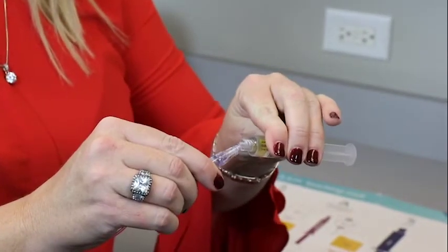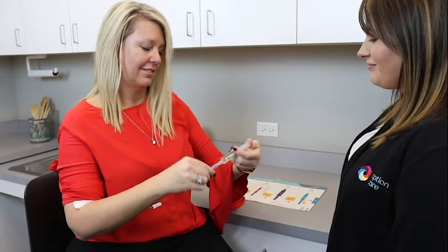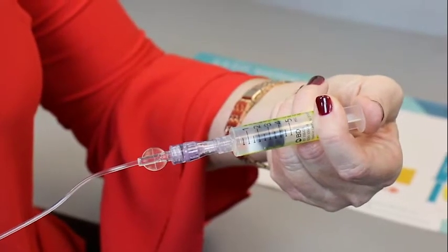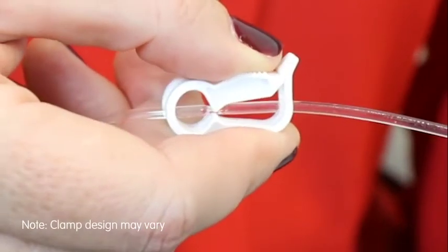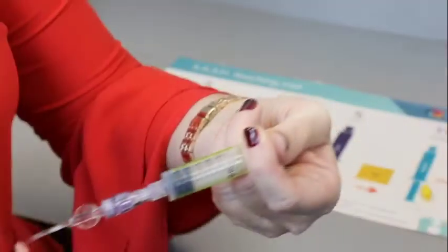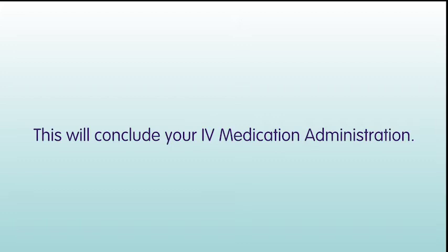Attach the heparin flush syringe to the needleless connector on your IV catheter. Flush your IV catheter using a push-pause method. Close the clamp on your IV catheter and/or extension set if indicated. Lastly, remove and discard the heparin flush syringe in a trash container, thus concluding your IV medication administration.